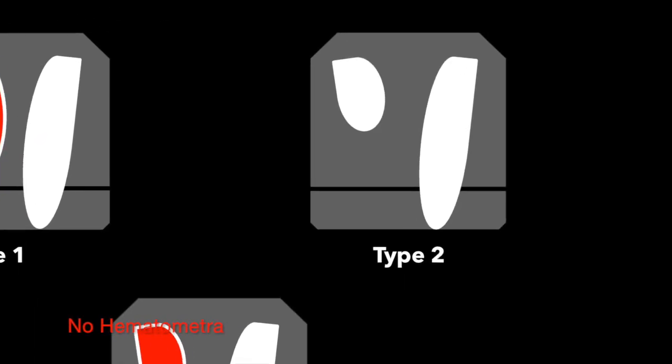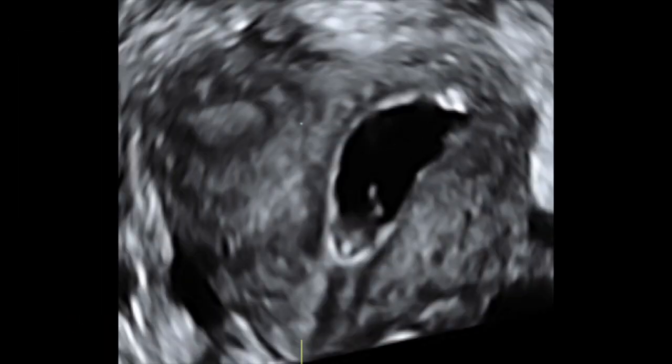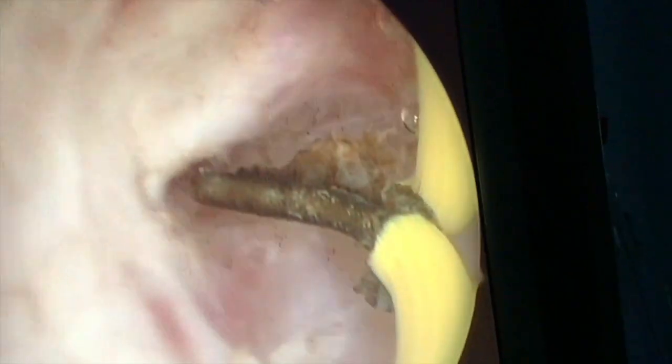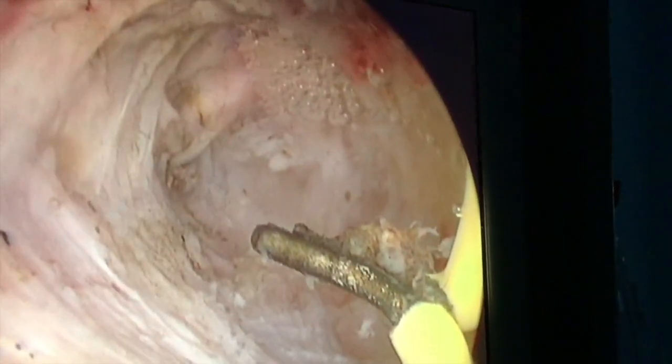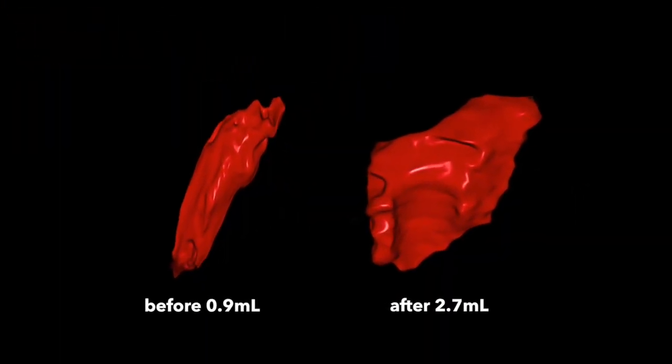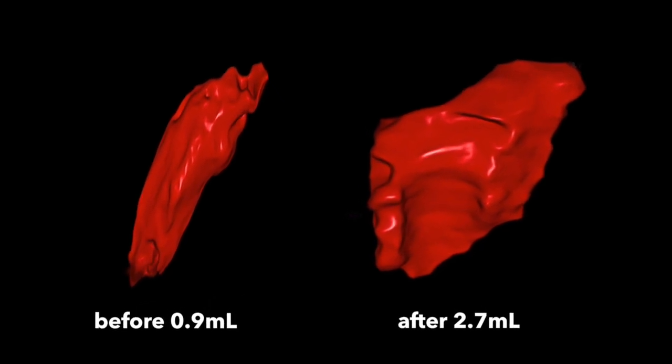The surgery of a Type 2 Robert's Uterus is considered in women with reproductive failures. It is more difficult because the endometrium of the blind cavity is less visible using intraoperative ultrasound than with a hemihematometra. Continuous ultrasound guidance should be considered to avoid false tracks and possible perforation. In this case, the blind hemi-cavity was found and in the final step of surgery the uterine cavity had a normal shape. A significant improvement of uterine cavity volume was observed after healing, but the connection was not persistent.